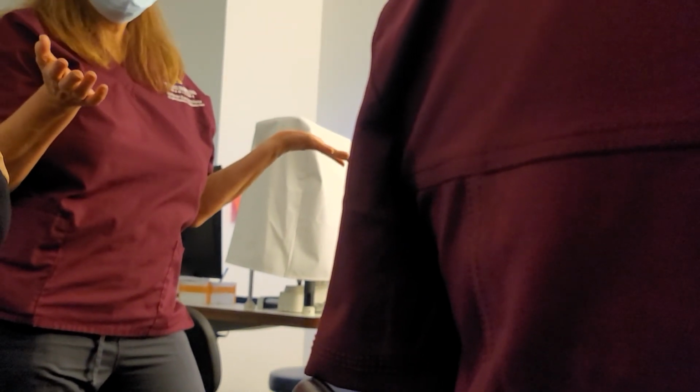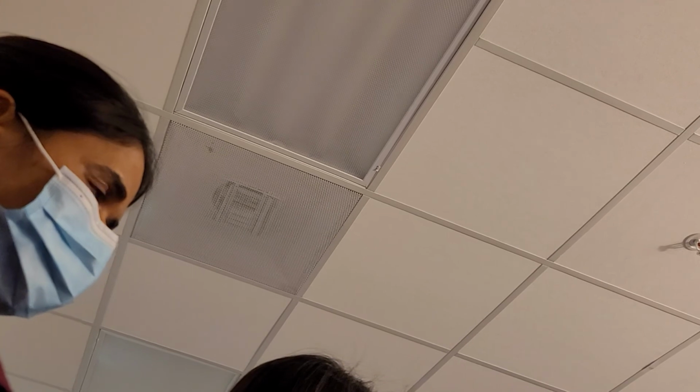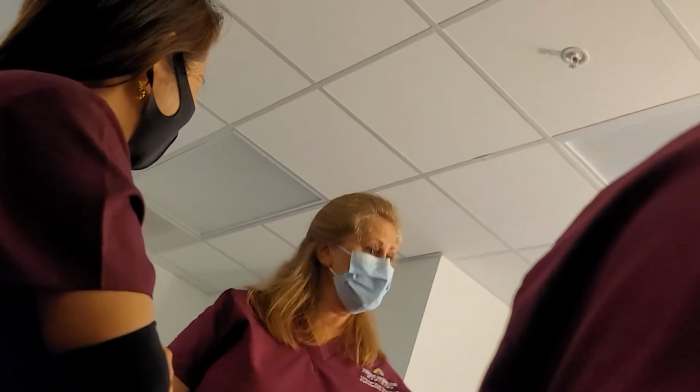You don't have to do a lot of talking and a lot of explaining to them. We are doing that here so you guys know, but you don't have to do that with the patient. Number one, the patient might not really even care. They're just here to get the test. How many times do you go in and they're taking your blood pressure or another image and you have no idea what they're looking at, what they get? An ultrasound, what'd you get? They're not gonna tell you I'm moving left and right, they're doing their job. This is exactly the same thing. They're not telling you if they're going left or right. You know what you need to do.